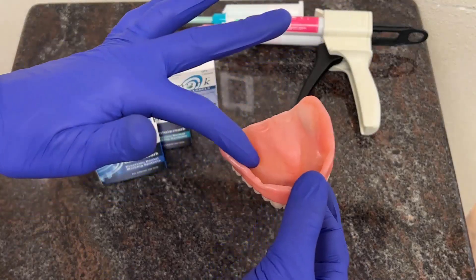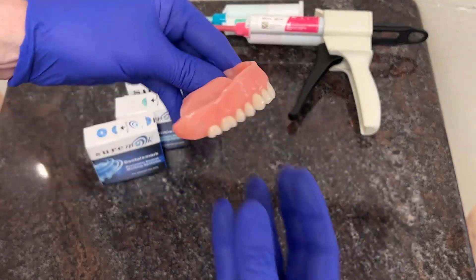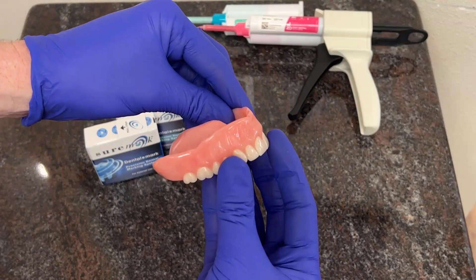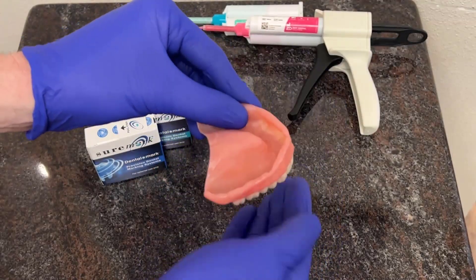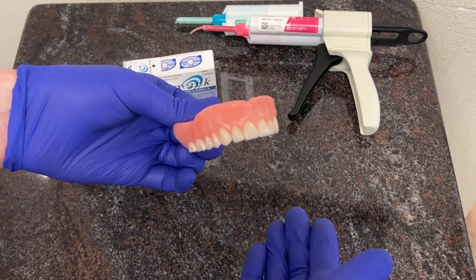Impression material goes in, you mix, it goes into the mouth, patient bites down, squeezes, slight border-molding, we can remove, and then proceed with the next stage.